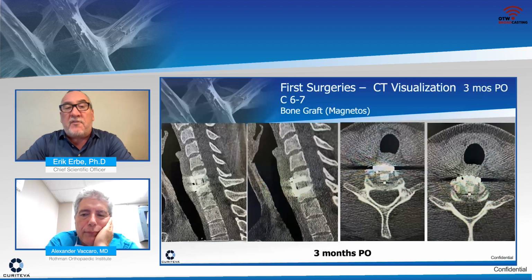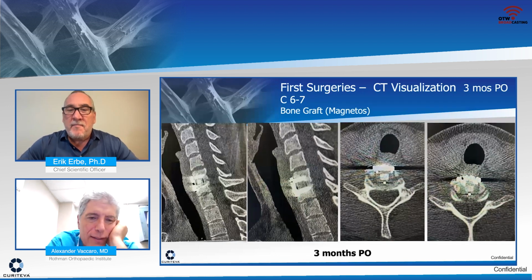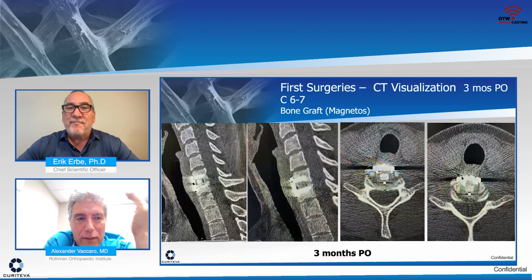Yeah, Alex, if you could comment on the benefit of knowing that that bone is infiltrating at this early 3-month time period, what that means for you as a surgeon in terms of your confidence of osseointegration and ultimately fusion. As a surgeon doing cervical spine surgery, you want to have your interbody spacer be sticky and stable at 6 weeks. And you can see on this 3-month x-ray, you're starting to see blurring of the end plates. You don't see any demarcation where there's evidence of non-healing. So you have a stable implant. And again, you don't need your plate after 6 weeks. In the future, possibly we can place this implant without an anterior cervical plate. So with this, we have the ability to visualize the healing process, unlike a titanium implant, where we may have a difficult time seeing it.